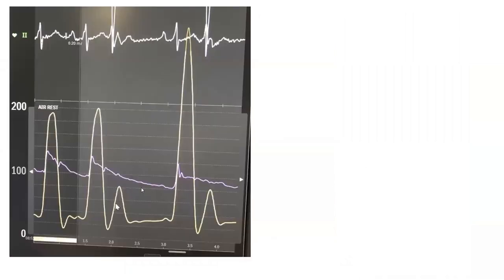And here is the PVC in this patient. Again, the Brockenbrough phenomenon after the PVC: spike and dome, late peaking LV pressure, and a striking increase in pressure gradient. The pulse pressure also dramatically declines after the PVC — that area under the aortic pressure curve dramatically declines compared to before.